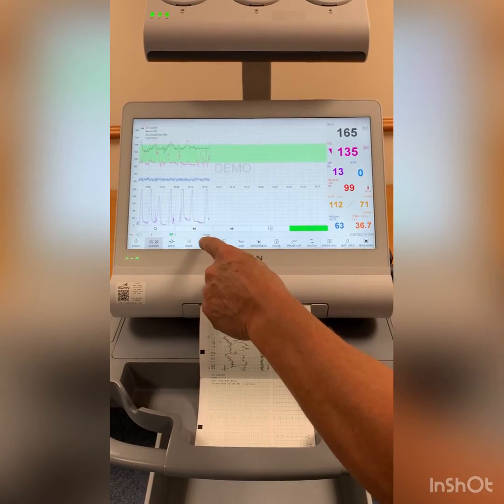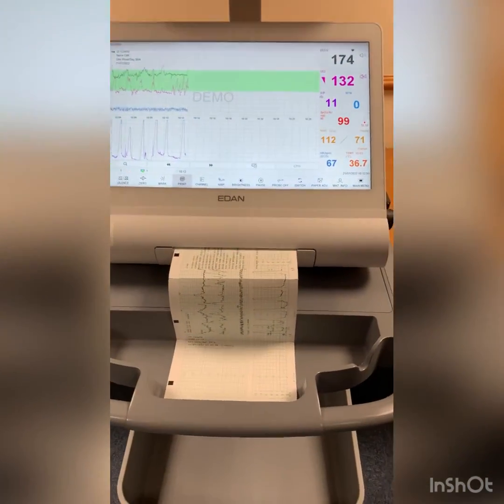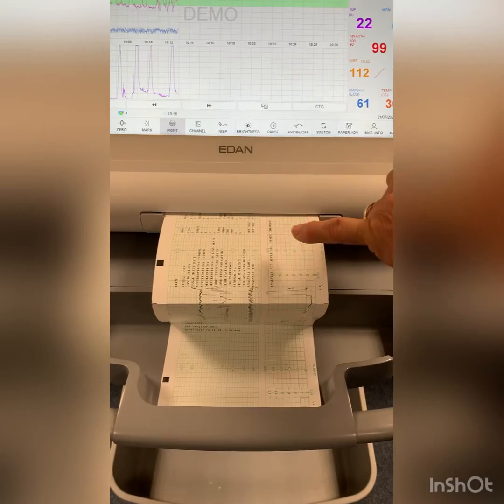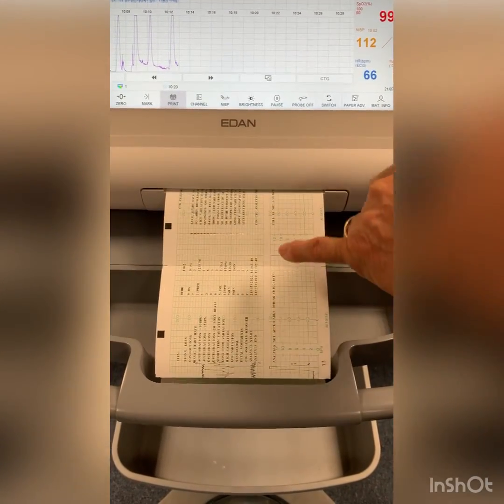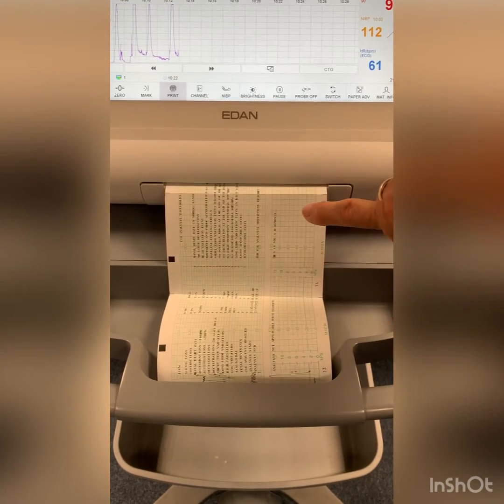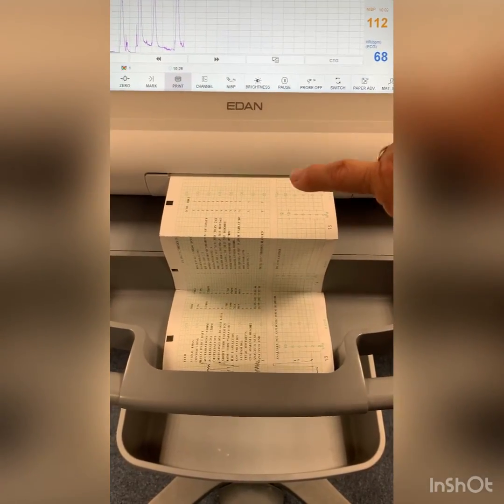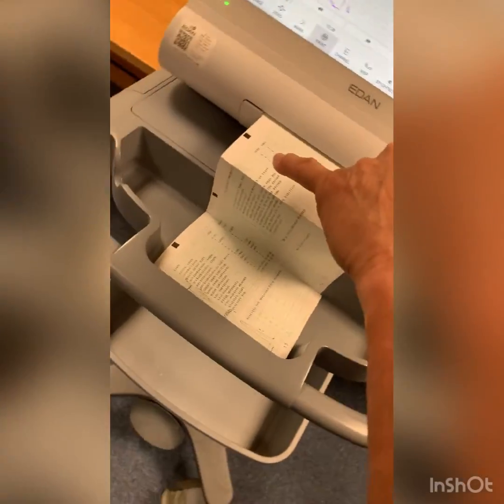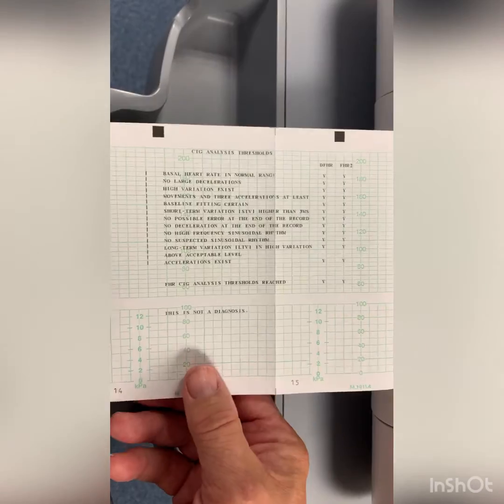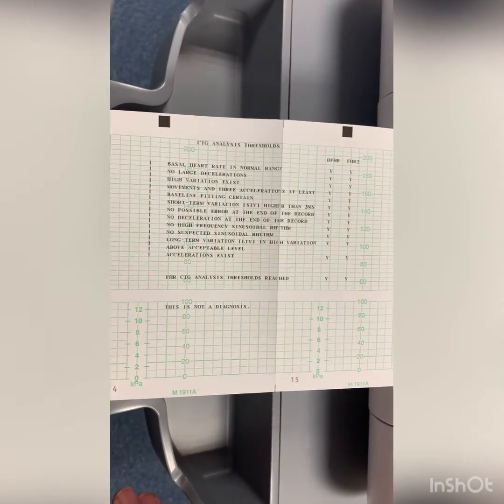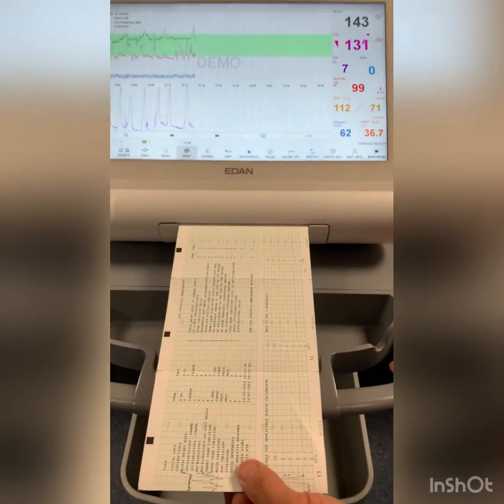We now just press the print button to print the CTG. You'll see at the end of the CTG it prints out all the numerics associated to the parameters it's monitored, and then it prints out the interpretation of all the parameters it's been monitoring. If we've met the threshold there's a Y, and we'll see at the final statement at the bottom of the trace: fetal heart rate CTG analysis thresholds reached — and there's a Y again, so both baby one and baby two.